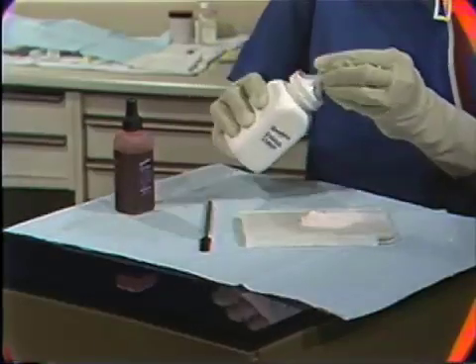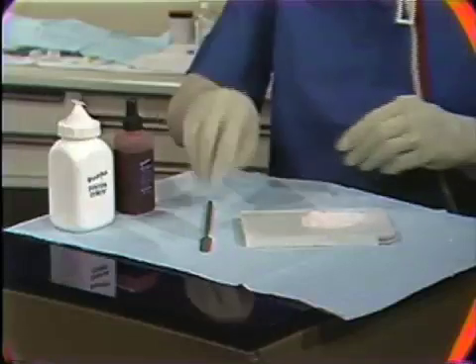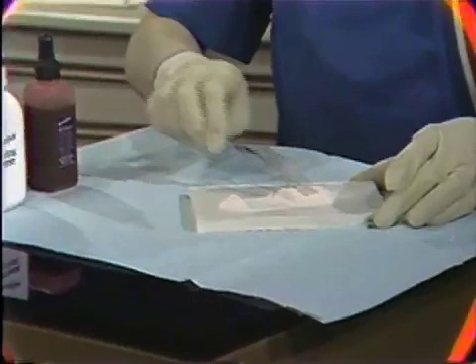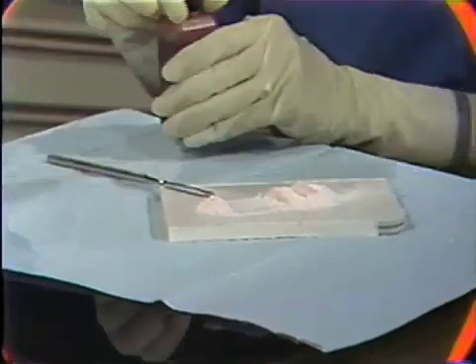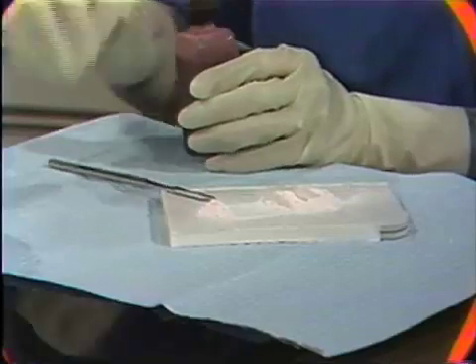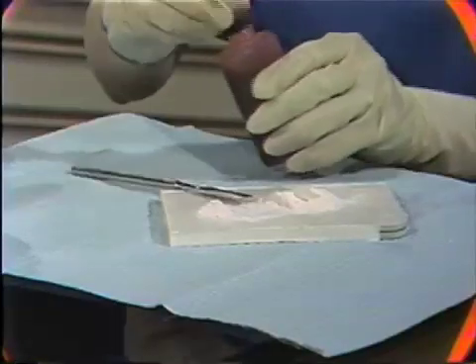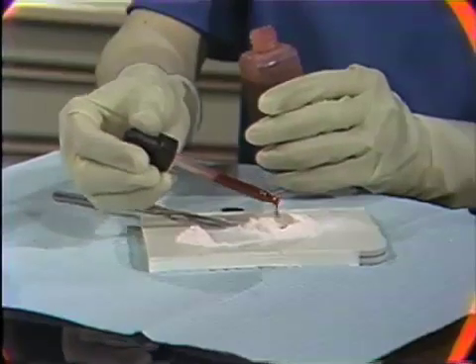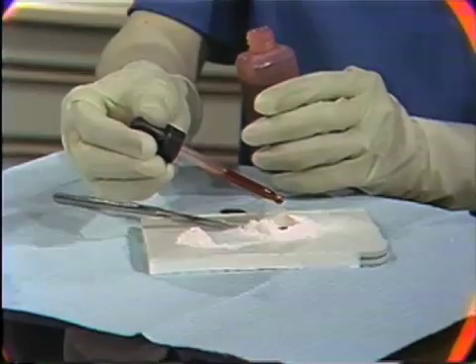You'll make a little hole in the center of this pile of powder, so it looks like a little crater. Notice how she also places a portion of the powder off to the side — that is reserved. She'll place ten drops now in the center of the pile of powder in the center of the mixing pad.